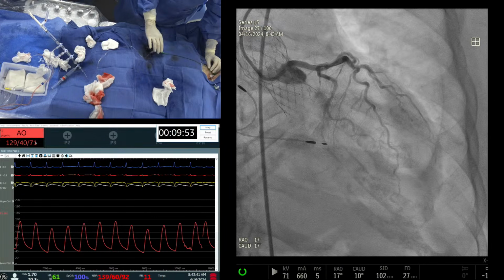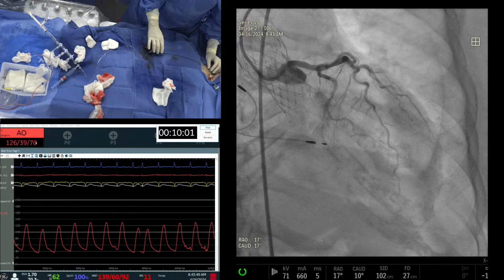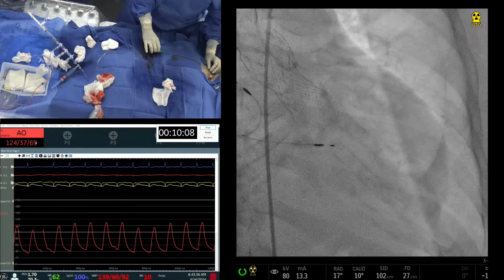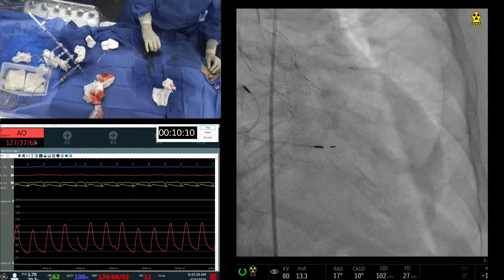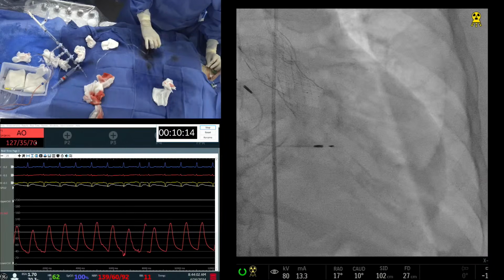Good. So anything else you need to point out? Now you take the catheter out. Do you want to take it out with the wire, or with the guide wire, or just this wire? No, I just showed taking it out under fluoro. Yeah. So you wanted to show that... No, they are right there. Yeah. So it can pop in again. Right, for a different angle. Pull it out a little bit and then come out.